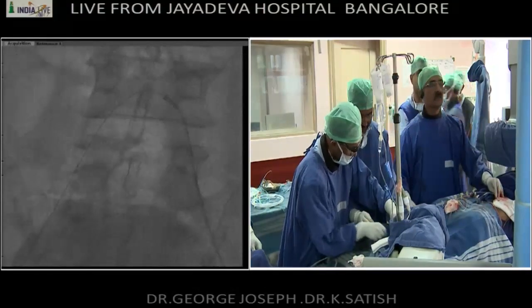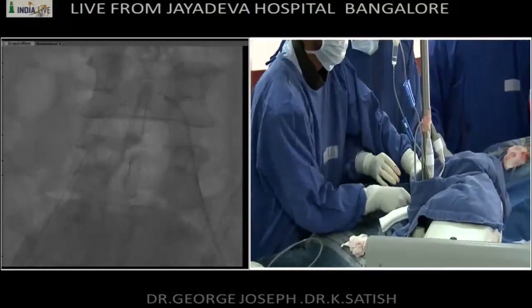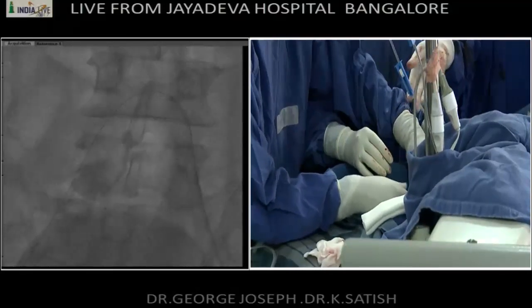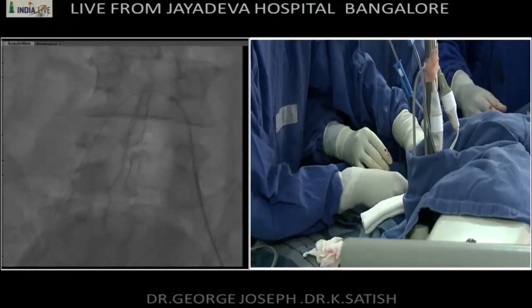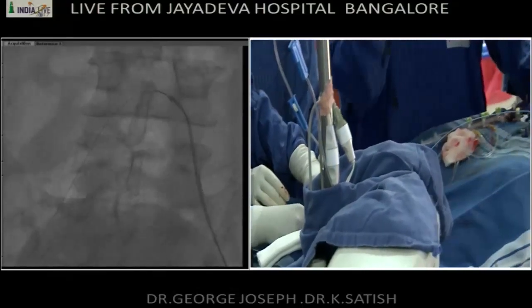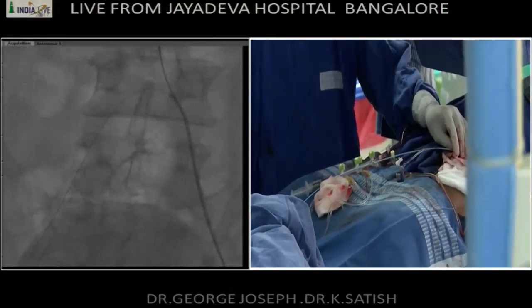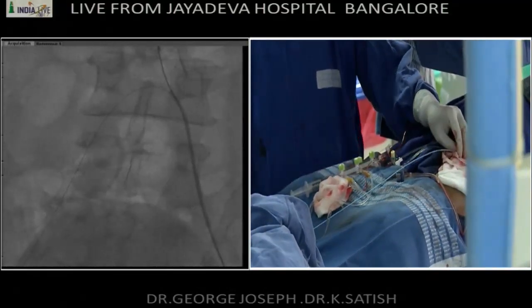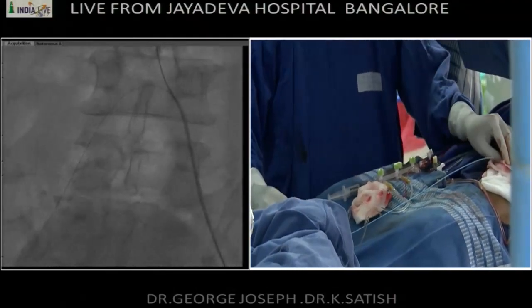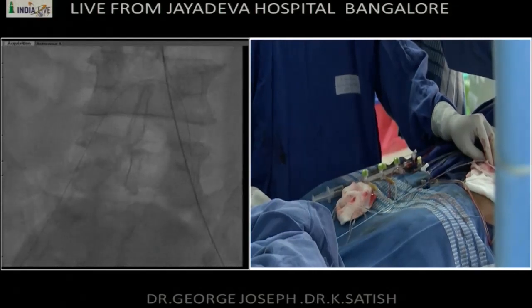Okay, so thermo coming in from the left side. You can buckle it up, no? Yeah, but it's all right. Here comes the thermo wire. Yeah, send it up. Let it go all the way up. Okay, so now we'll remove this catheter. So I've got my left wire in. And I'll repeat that maneuver from the other side.